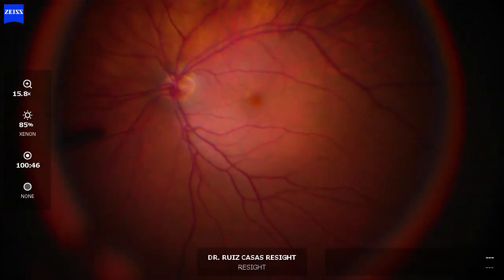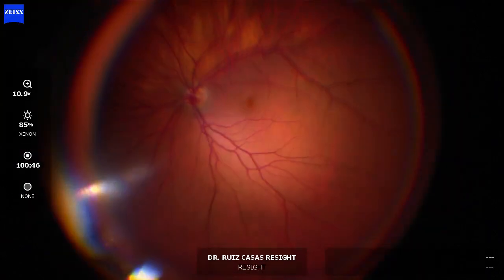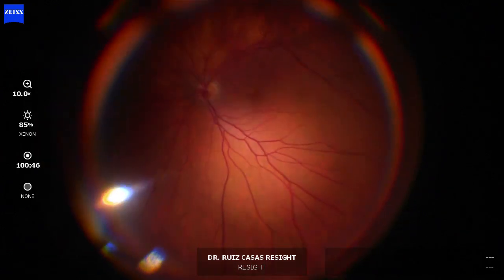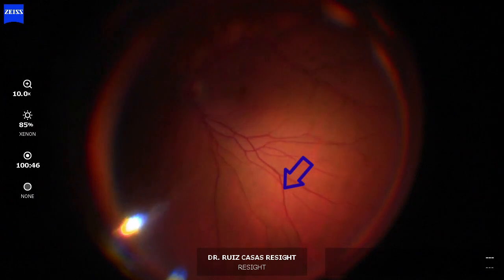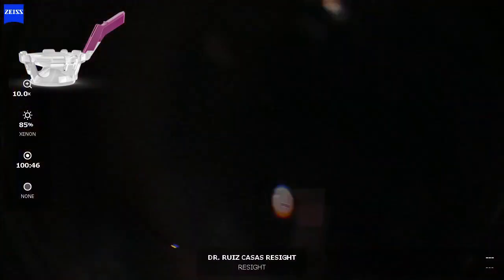This is the comparison between the two lenses. This is the non-disposable lens, the normal yellow one. You can see here the vessel crossing, which is quite peripheral.